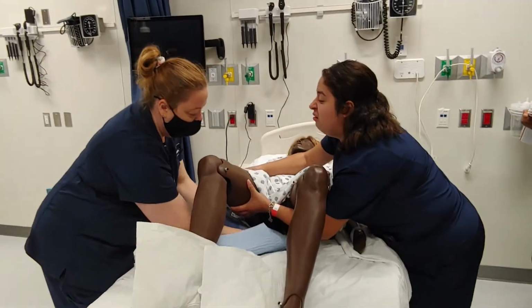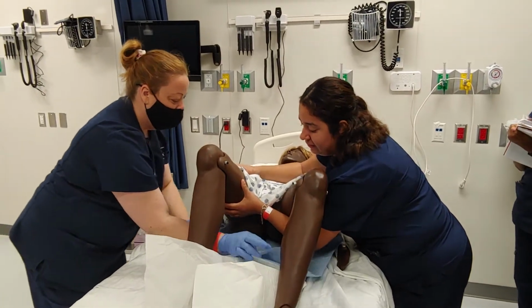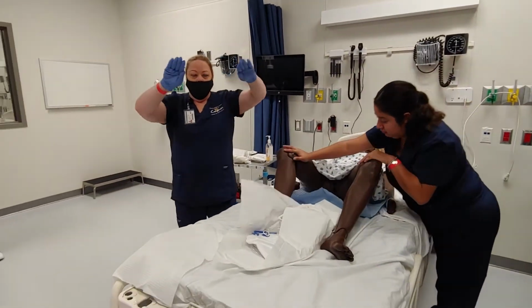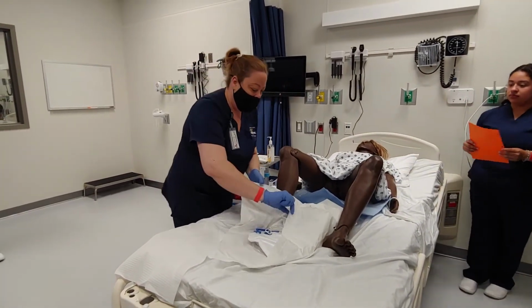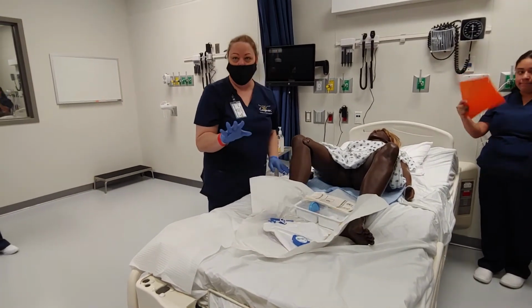They would lift up their hips. I know, he's heavy. Lift up their hips. Okay, go ahead. Just enough to get them under, okay? But again, we fold it under, slide it, and let it go. All right? So now we're ready to go ahead and start setting up the rest of our sterile field.